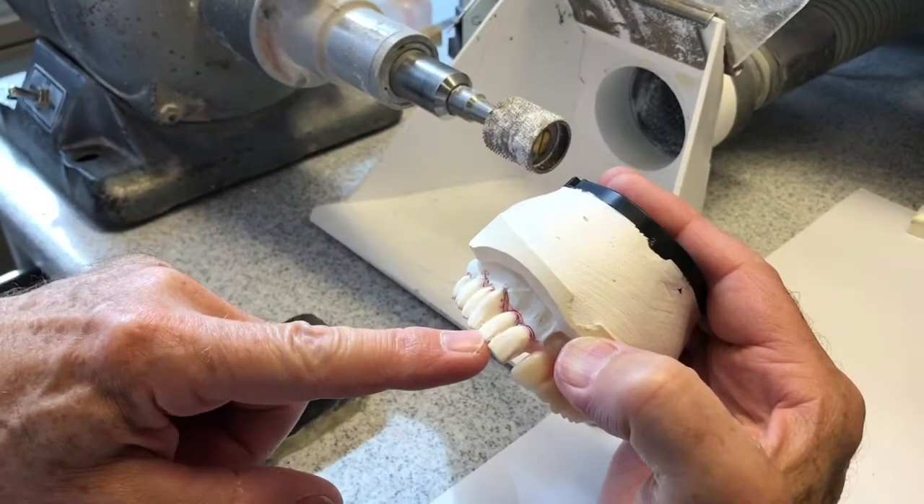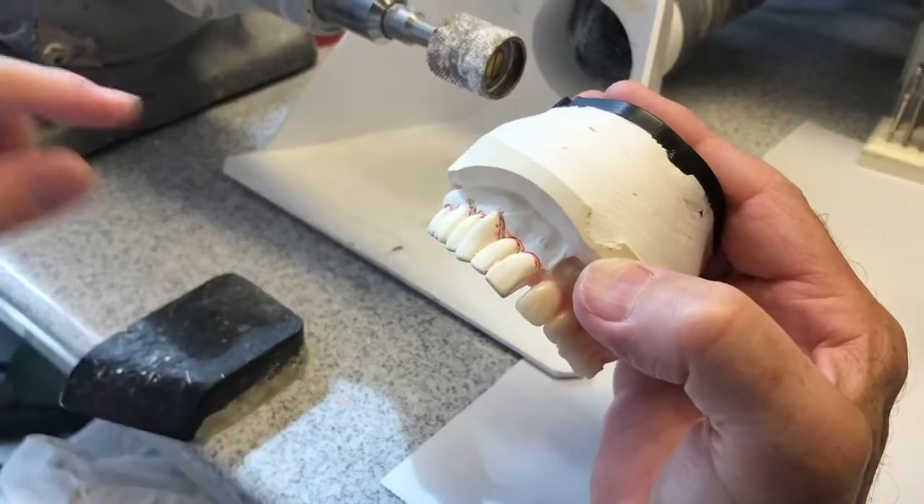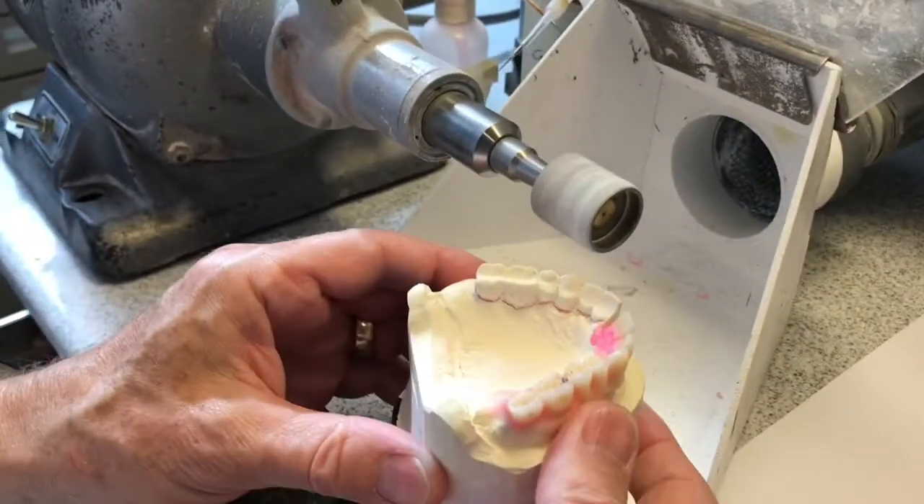Okay, I'm going to grind these teeth off. I'm going to take away the teeth and not the bone.